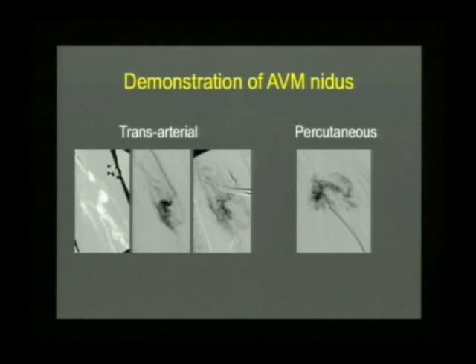Not always easy. But for example, there are 3 locations of nidi in the distal forearm and 2 in the palm here. And I know these are not very clear, but the nidal channels are extremely small, and I'll show you them in more detail just now.